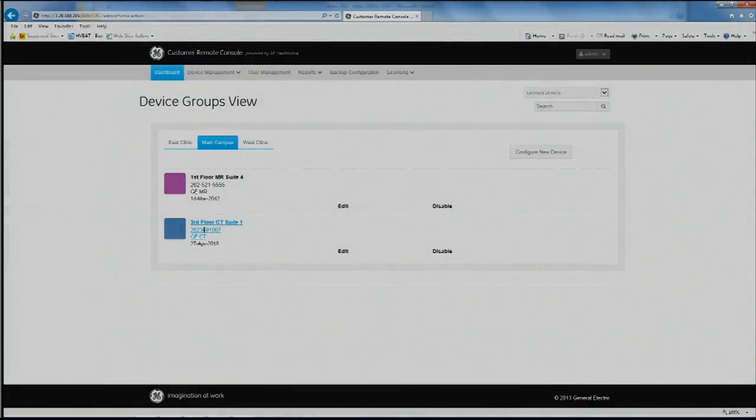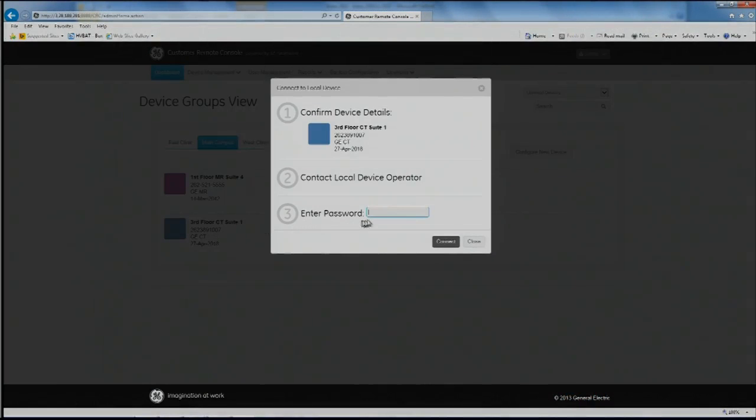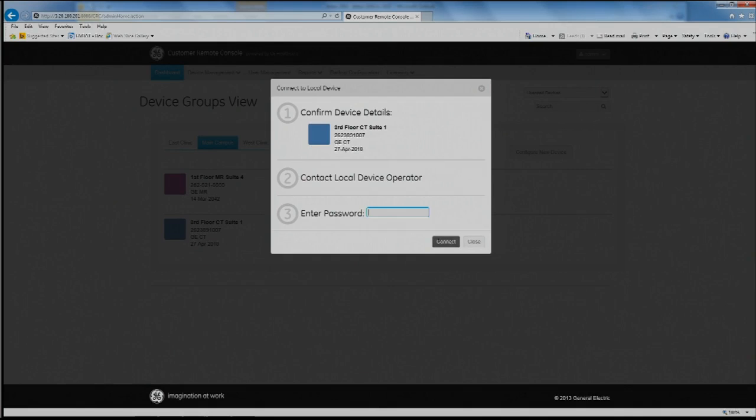On the Remote Console dashboard, click the device you want to connect to. The Connect to Local Device dialog box appears.